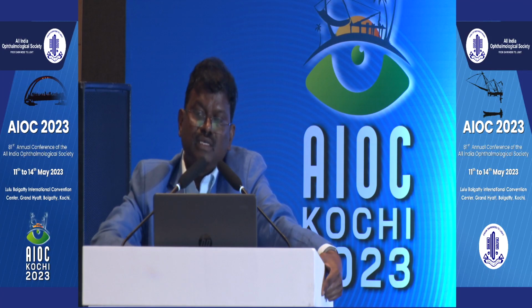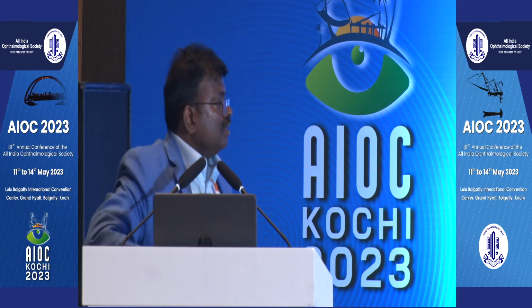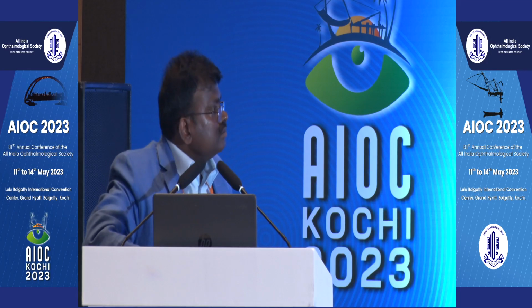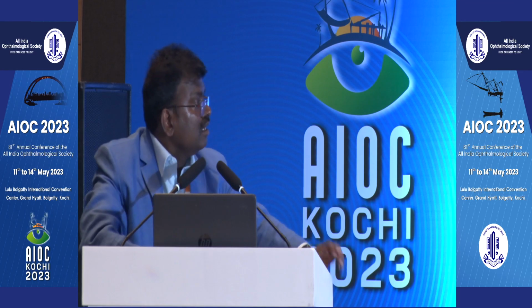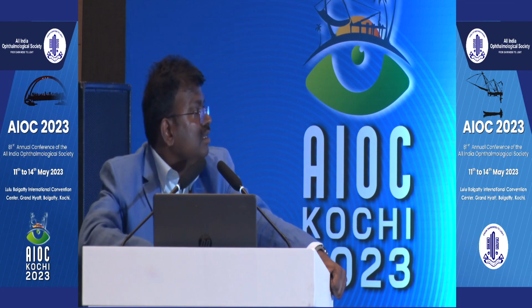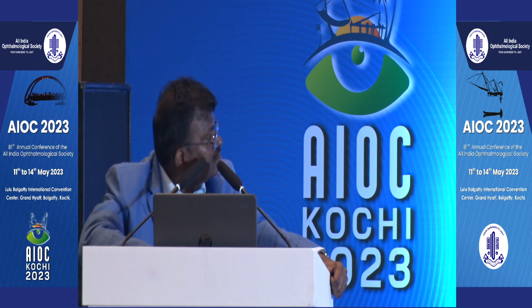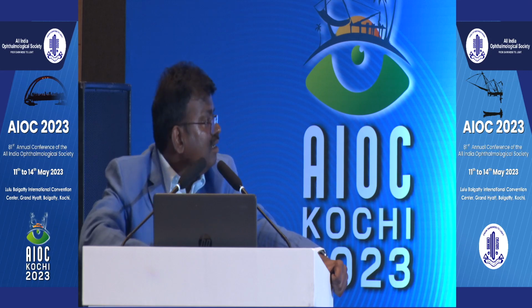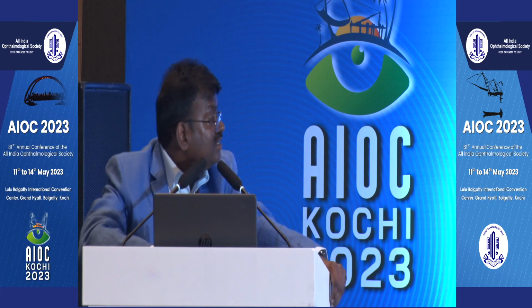Dr. Naresh, that was a super excellent portrayal of how to think out of the box, think out of the eye, and go in and remove the subretinal gliotic bands. The surgery was really nice because it removed all the bands so effectively. But tell us, how did you think of this? No, no, did you think out of the box? I have already told, I have not done anything new.